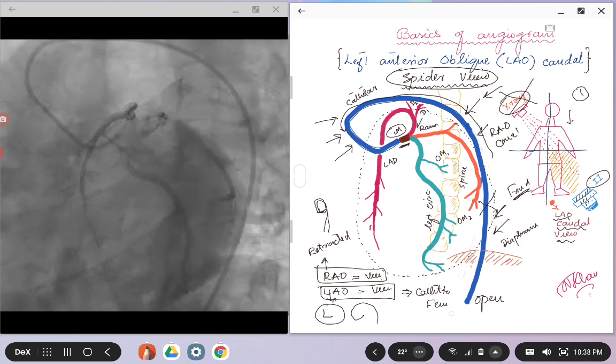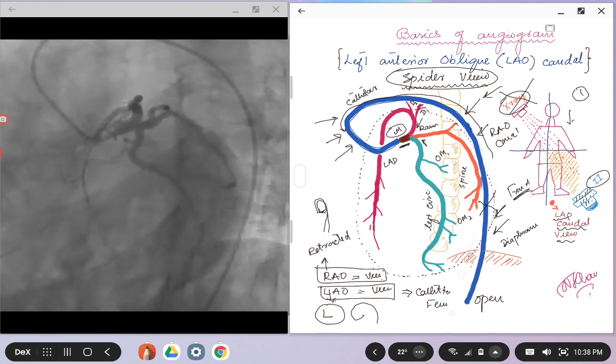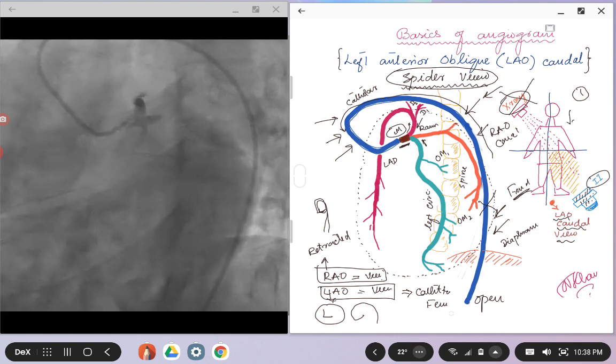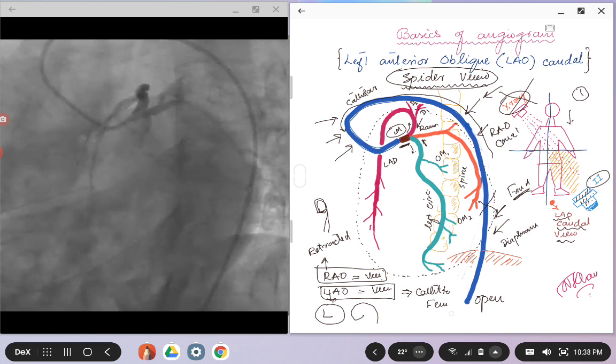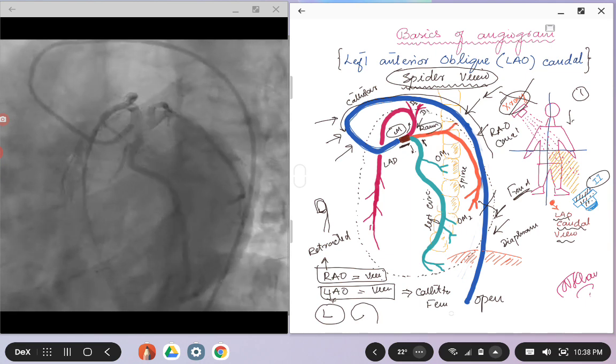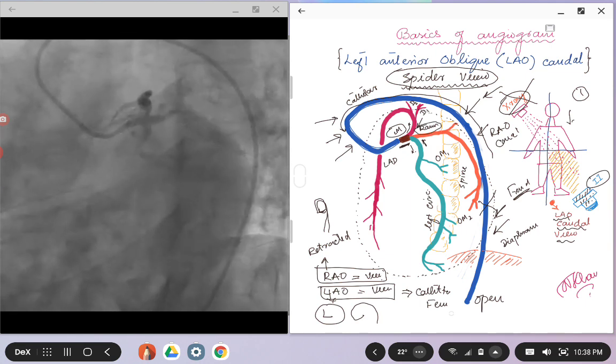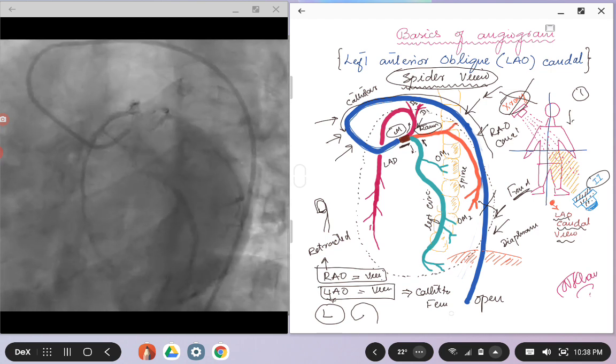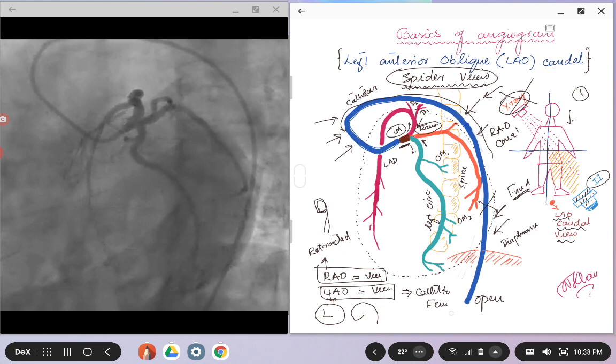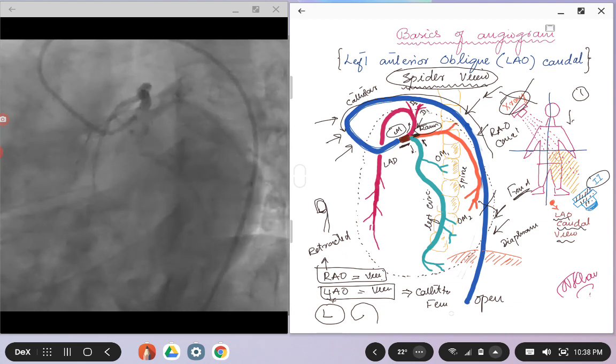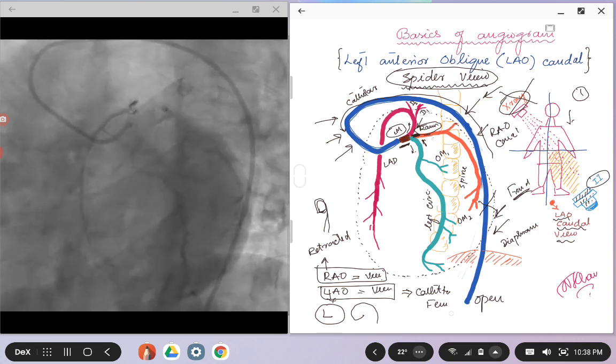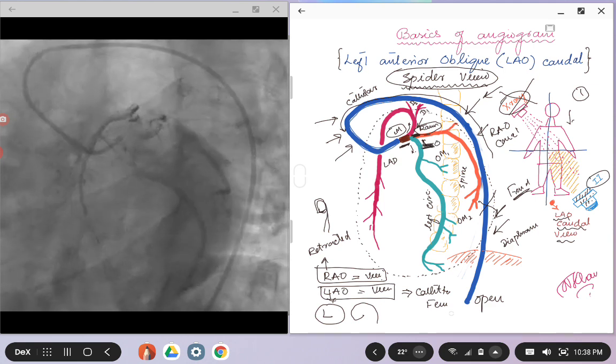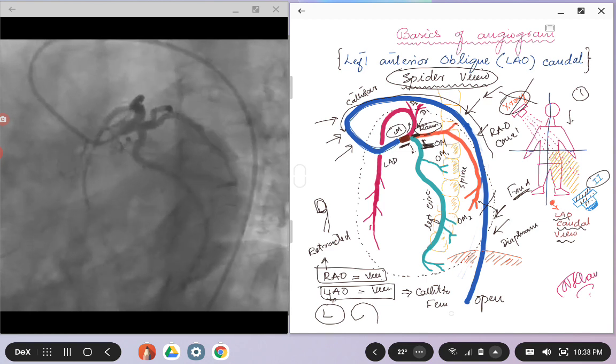But the most important thing is the bifurcation. So you can see how nicely the LAD, the left circumflex, you can see their origin, their ostium, and this is the view where you can see if the patient has got a ramus or a ramus intermedius. So if this artery arises just at this fork here, as in this case, this is a ramus. And if it is slightly lower, then it will not be called ramus, then it will be called an OM branch.